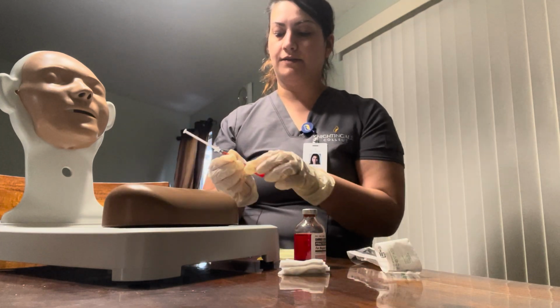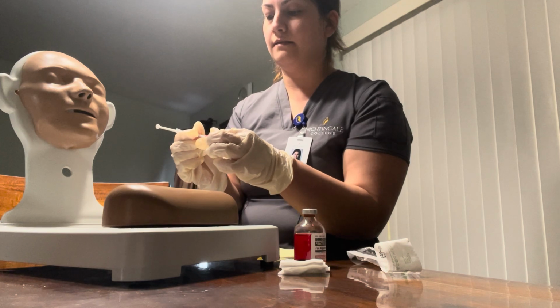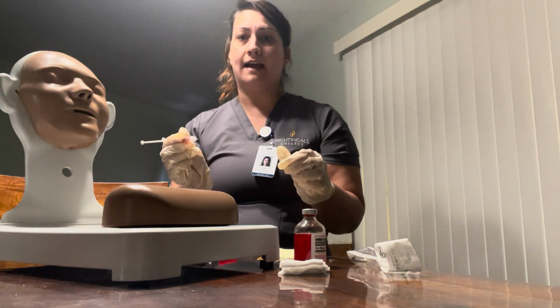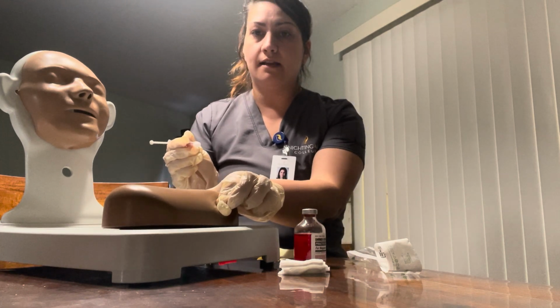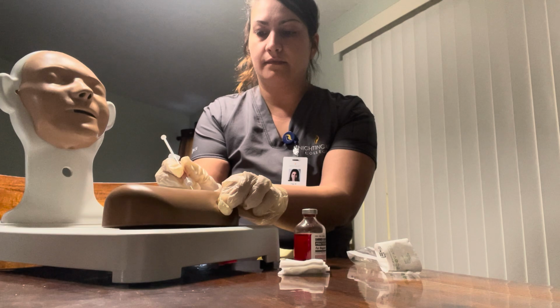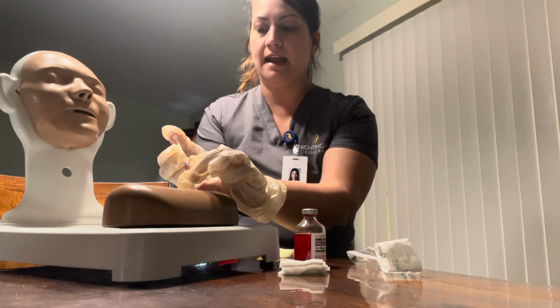We're going to grab our syringe. We're going to use the non-dominant hand to take off the cap. We're going to go at a 45 to 90 degree angle. I'm going to grab with my dominant hand, and we're going to quickly insert it like a dart, palm down. I'll grab it here with my dominant hand. I will push in the medication.